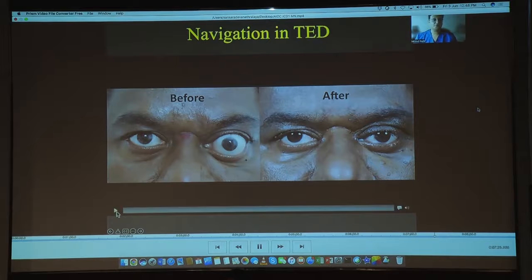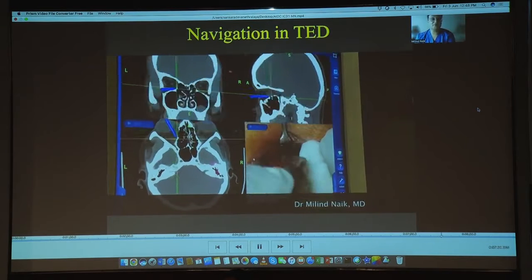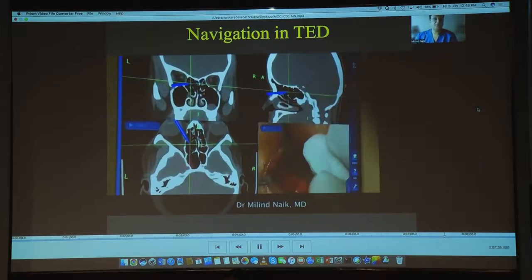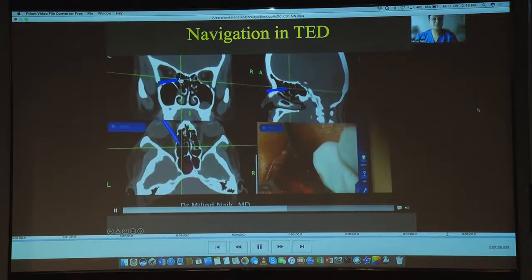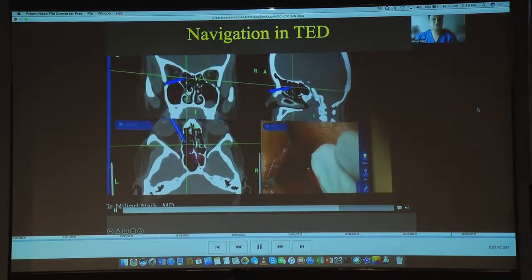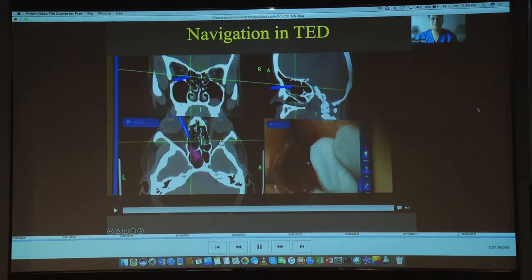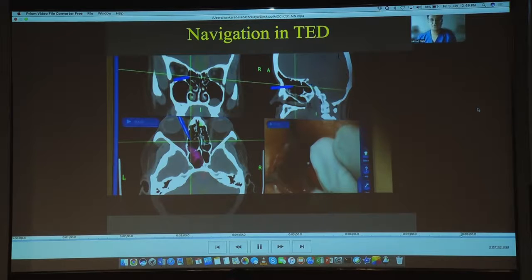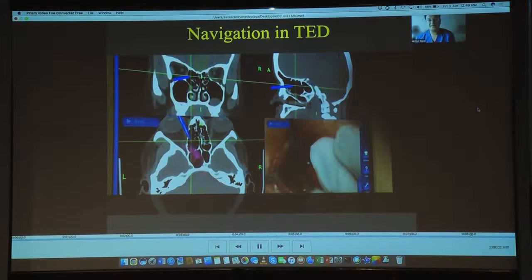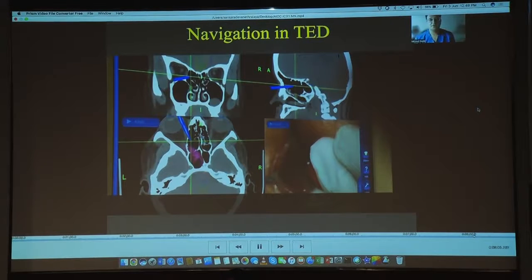Finally, coming to the role of navigation technology in thyroid eye disease: medial wall and lateral wall decompressions are the two areas where we use navigation effectively. Here you can see the navigation probe located in the ethmoid sinuses, confirming the medial wall has been decompressed. Navigation indicates how far you can safely go toward the posterior ethmoids and helps keep you away from the cribriform plate. Similarly, in deep lateral wall decompression where you are handling the greater wing of sphenoid closer to the dura, navigation technology helps maintain a safe distance from the dura.